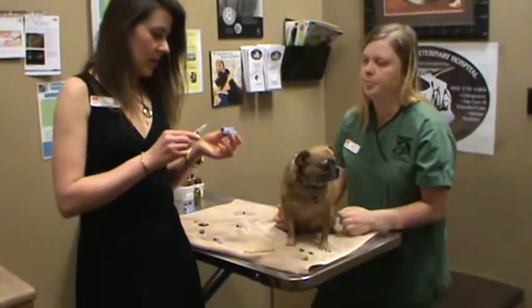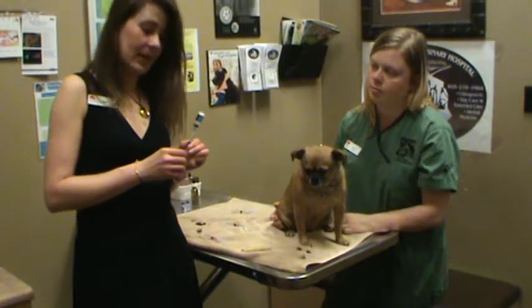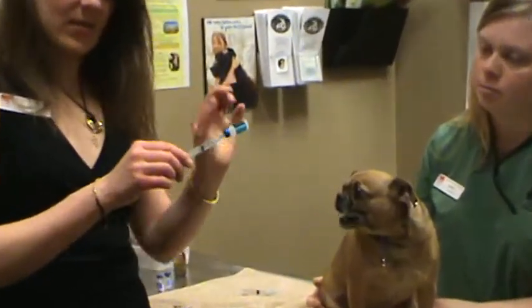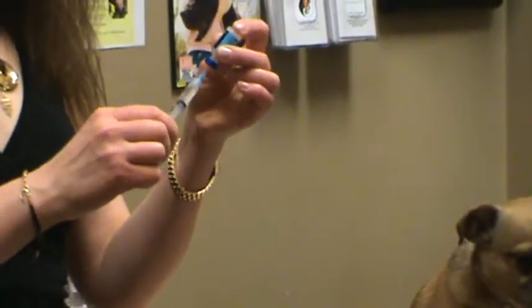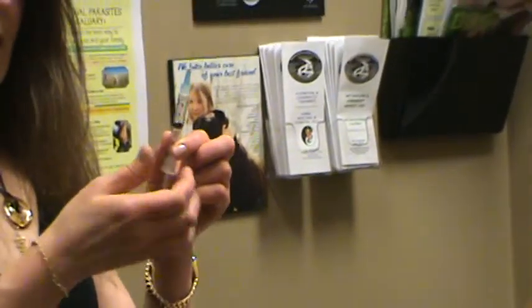It's important that you never touch the needle with your hands. Basically, you want to push the needle into the vial that you need to withdraw the medicine from, right in the bullseye — there's a little circle, so you want to get it right into the bullseye center where the rubberized center is. Then you basically withdraw, and sometimes you'll get air bubbles.